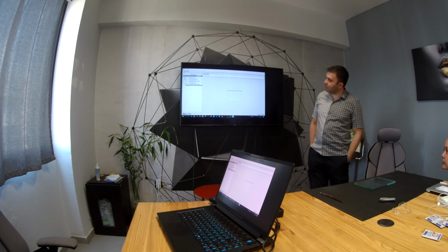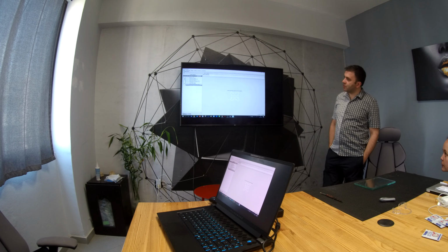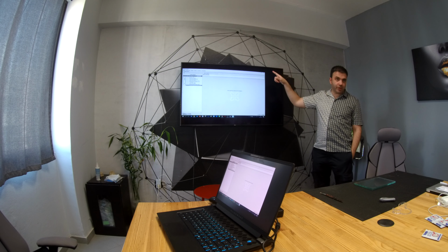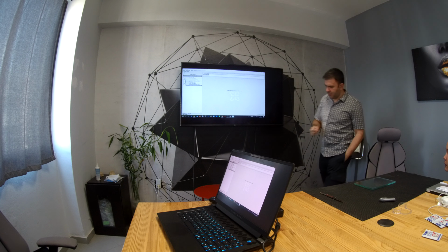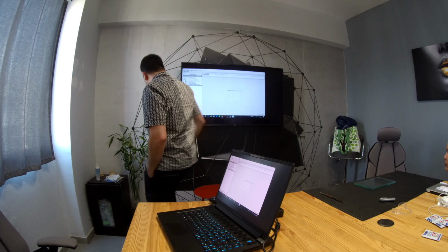So he's going to axiography right now. So complex diagnostics. You choose what you want to use. I don't think you will use... I'll stand here because I won't say anything. Yeah, good.